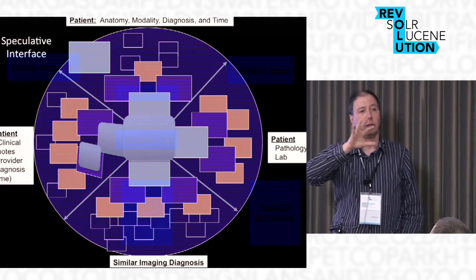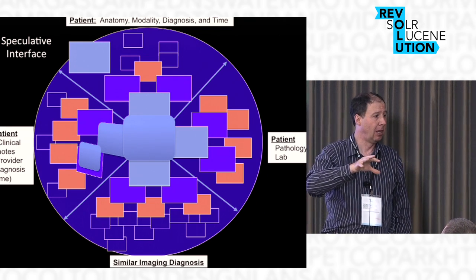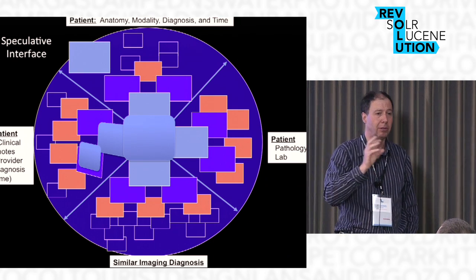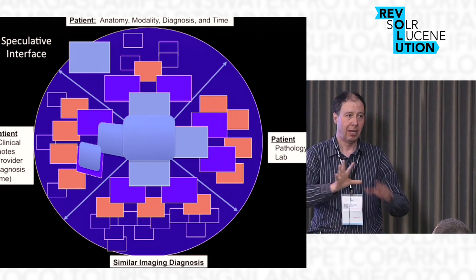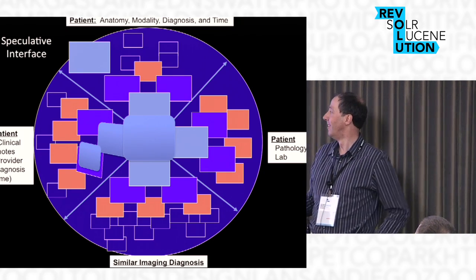By the way, just so that you're totally clear on this, all the searching and all the stuff that we're doing is on the text, and they have links then to the images. So we're not doing any searches on images. So the case where we had the mass in the hand, it wasn't like we sent that out and tried to do image matching. That's a whole other story.